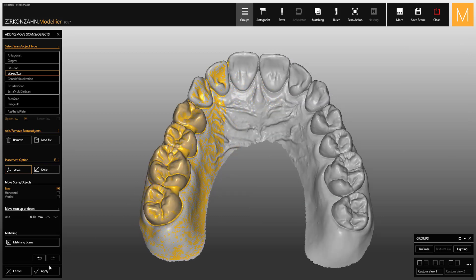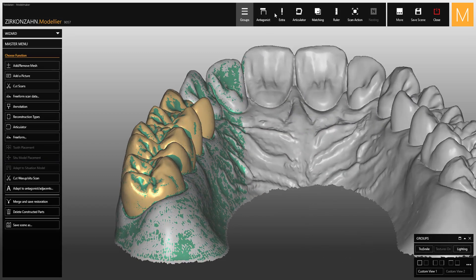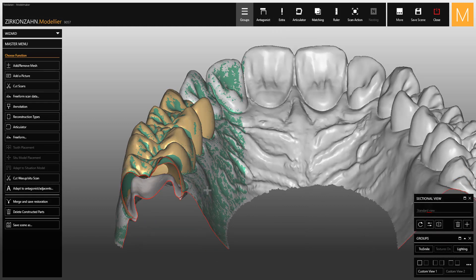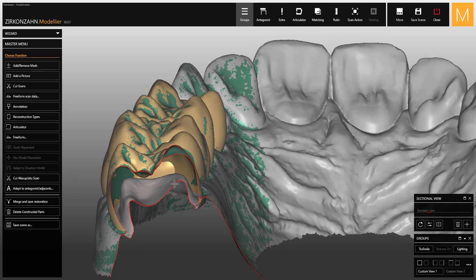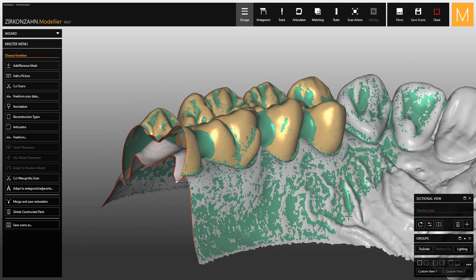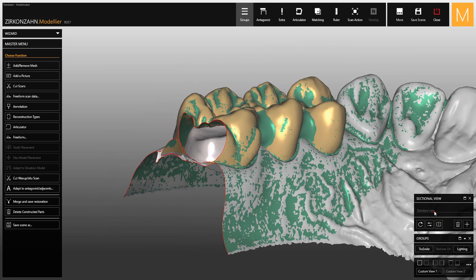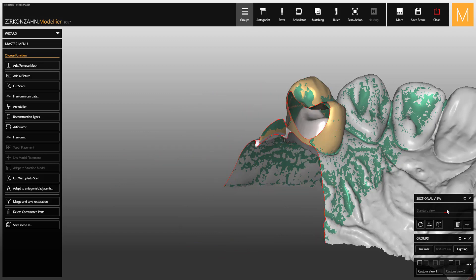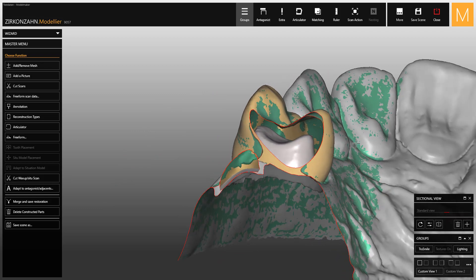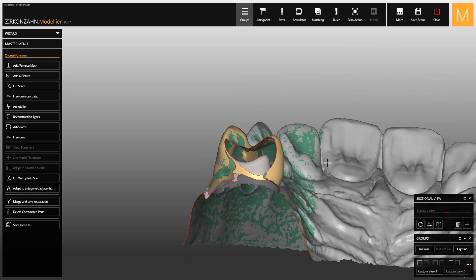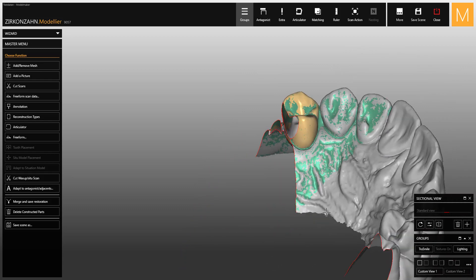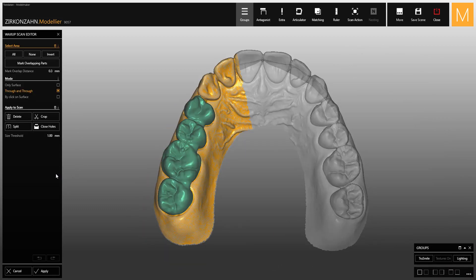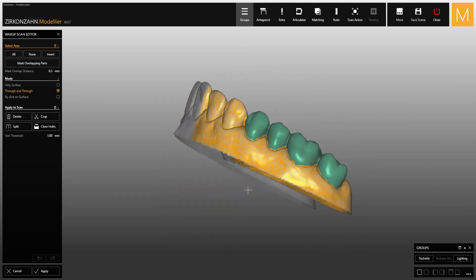Once finished, close the matching window and apply the changes. With the sectional view tool you can see the differences between the old and the new job. With all changes made by the dentist, select 'Cut Wax-Up/Situ Scan' to cut and clean all unnecessary parts of the wax-up scan.